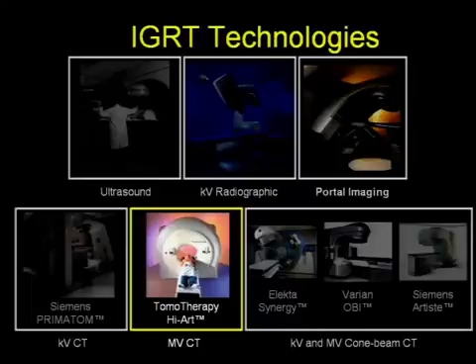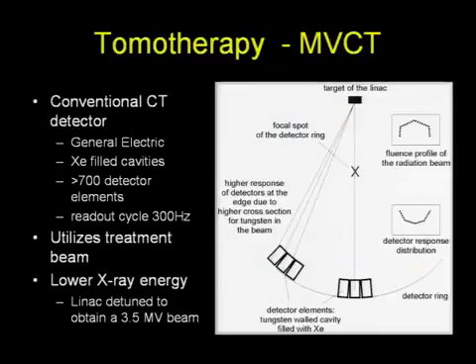The other image guidance technology that is commercially available is the Tomotherapy system, which again is a conventional CT with a linac mounted on it.